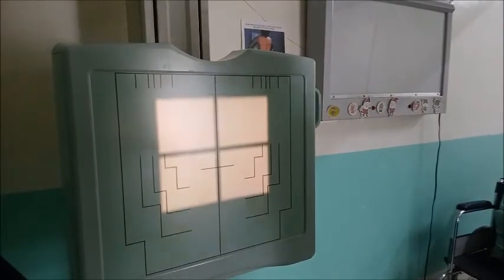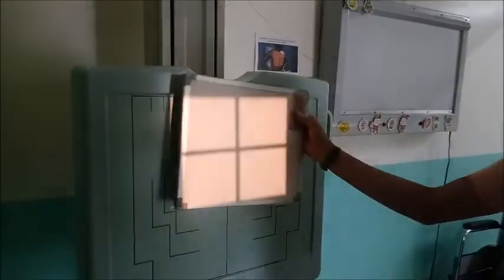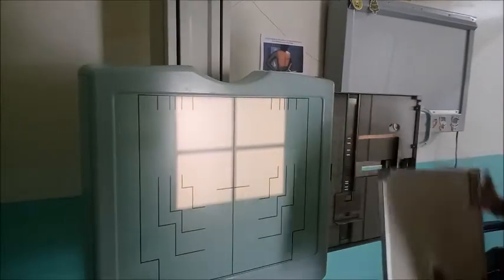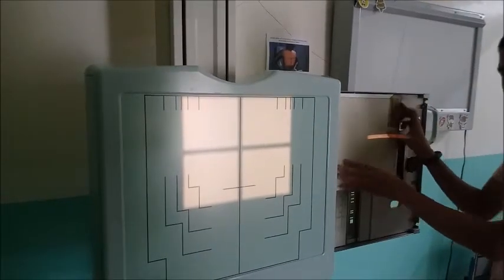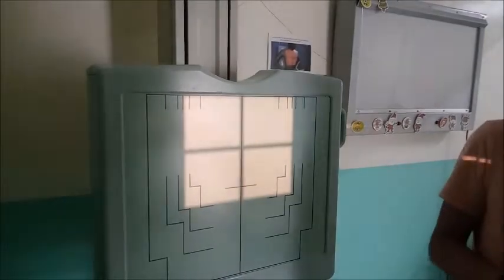Tapos iyahang top to bottom. That means this is the only area that will be exposed to radiation. And if you have a patient, so muna po na siya na area na exposed sa outside.